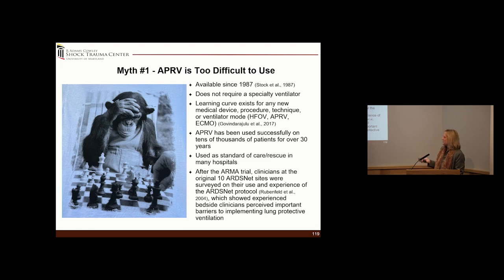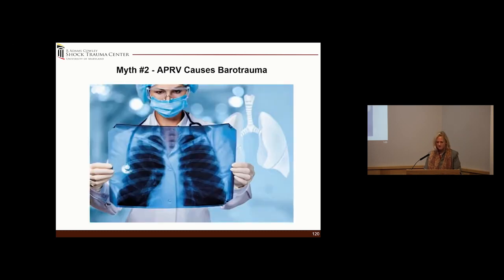And this is the real interesting thing: after the ARMA trial, they did a questionnaire with the top 10 sites that had the ARDSNet study trial there. And they found that they perceived there were a lot of barriers. The PEEP FiO2 scale, it's not that easy to use. So again, we don't believe that APRV is the only mode with a learning curve.